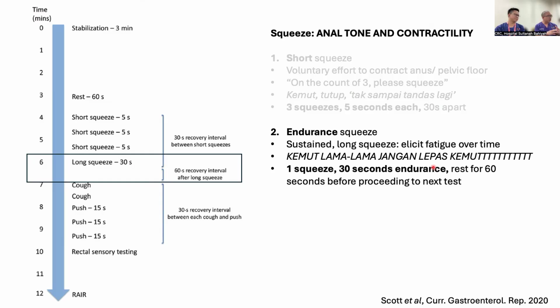If the patient tells you, I have incomplete evacuation, I poop already but I still feel something, it's not complete. Or they tell you the stools are hard, Bristol stool type 1 or type 2. And the patient has told you that I've tried laxatives, but it doesn't work. Then you need to start thinking whether this so-called patient with chronic constipation has a defecatory disorder. In that sense, you might need to consider a test, an anorectal manometry test.